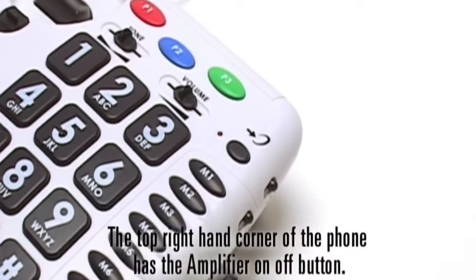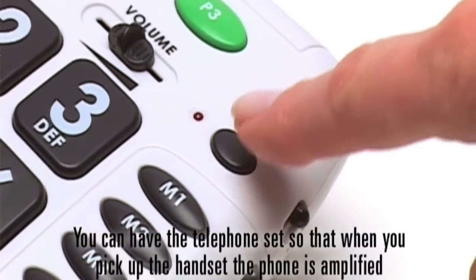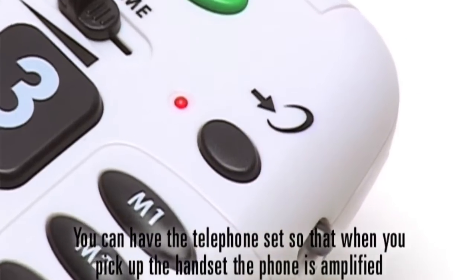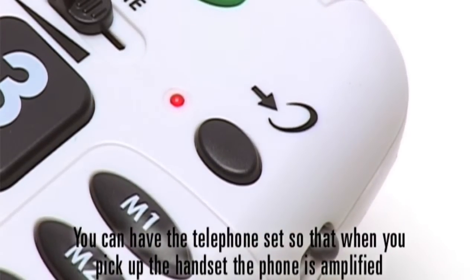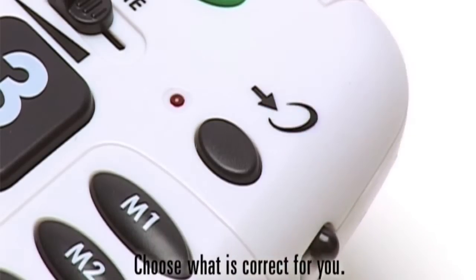The top right-hand corner of the phone has the amplifier on/off button. You can have the telephone set so that when you pick up the handset, the phone is amplified. Or you can have it set at regular volume — choose what is correct for you.